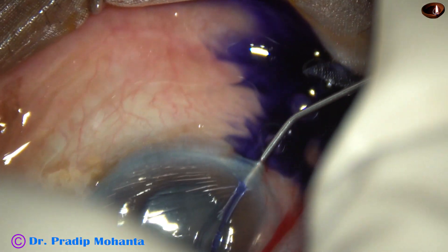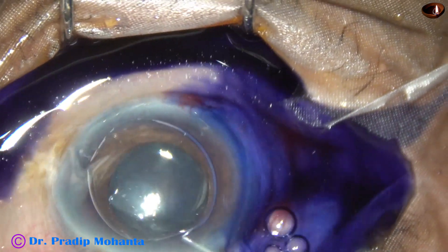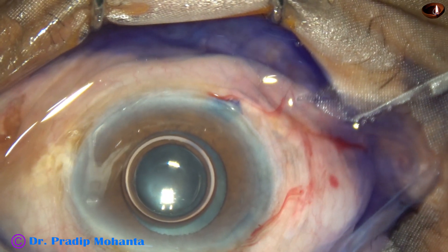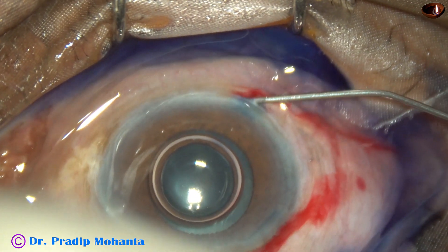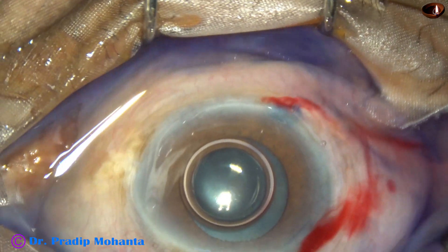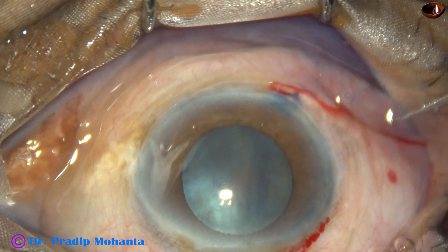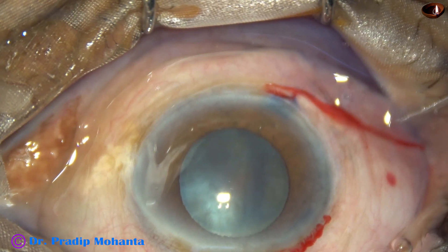By this time the incisions have been made, and at this time the anterior capsule is being stained with trypan blue dye. Adrenaline has been administered in the anterior chamber but the pupil did not dilate much. However, the size of the pupil is about 4.5 mm and if this dilation remains we can manage this case. As I inject viscoelastic, the pupil has dilated a little more, so it has become about 5 mm.